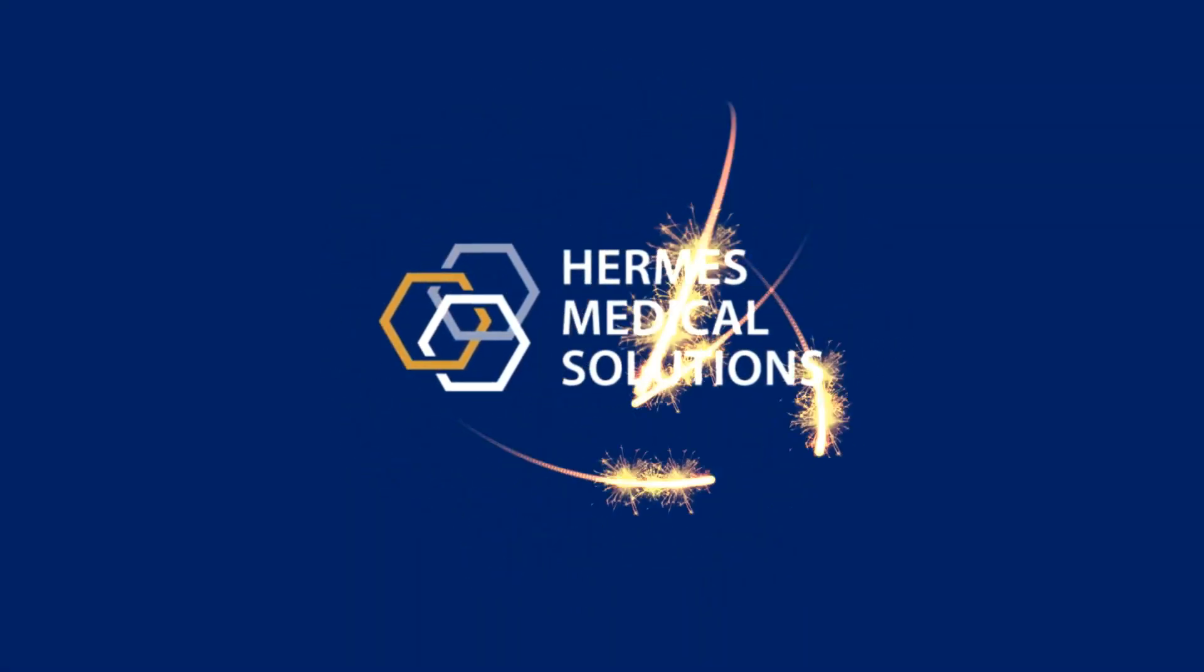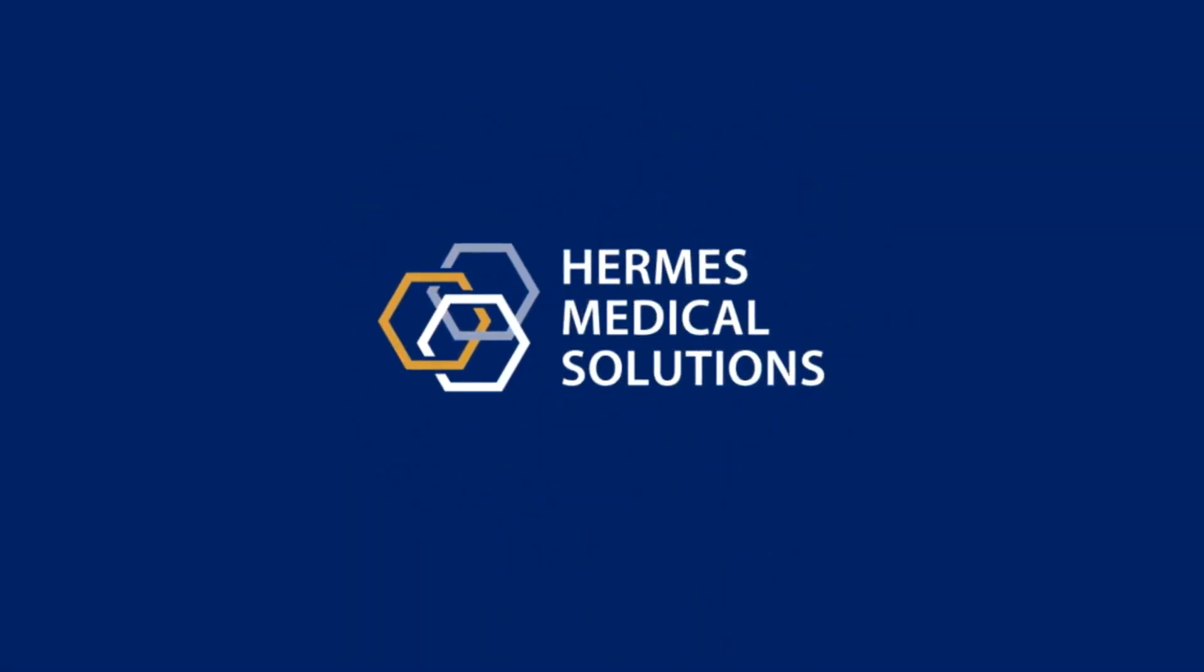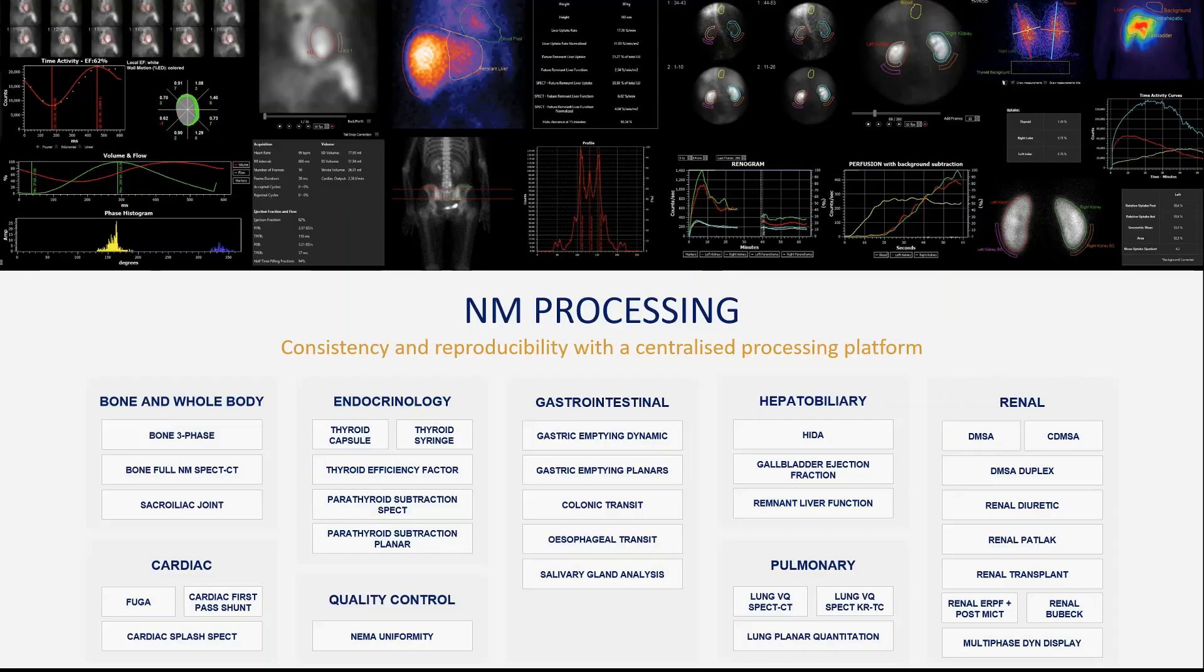Welcome to a brief introduction to some of the nuclear medicine processing tools available from Hermes Medical Solutions. We're going to start first by looking at DMSA processing.